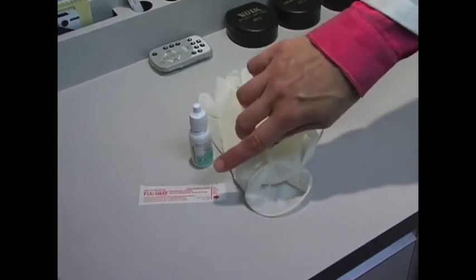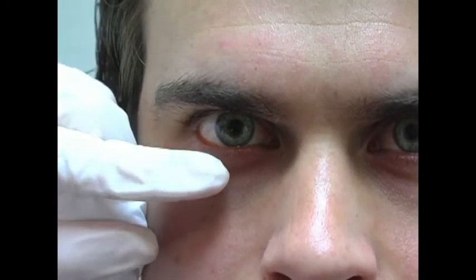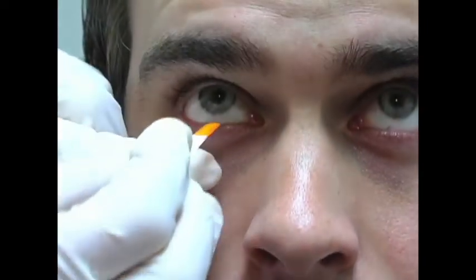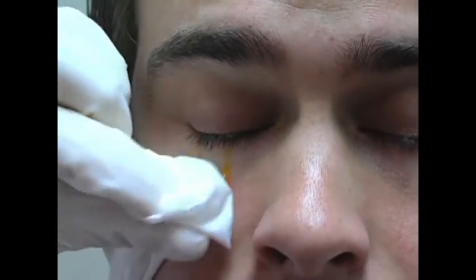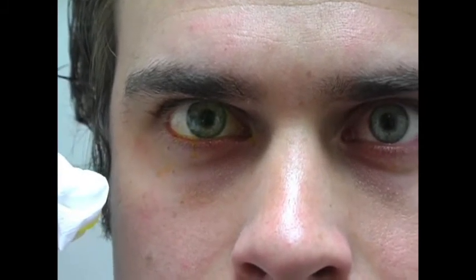You will need a fluorescein strip, topical anesthetic, and gloves. To apply fluorescein, place a drop of topical anesthetic on the fluorescein paper strip, then touch this wet paper to the posterior surface of the lower eyelid. Make sure you use a fresh, unexpired bottle of anesthetic for each patient. If the patient is having severe pain, a drop of topical anesthetic should be instilled in the lower fornix prior to fluorescein instillation. Of note, if pain is completely relieved with the topical anesthetic, a problem with the cornea is likely.